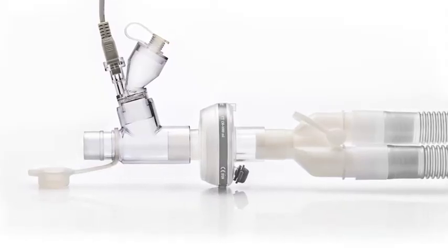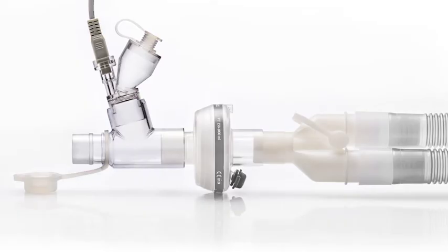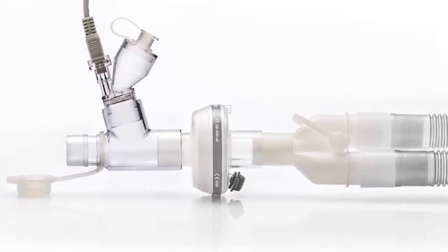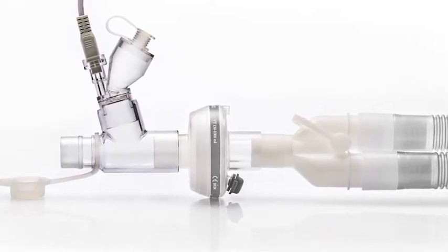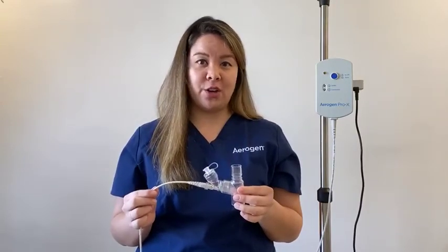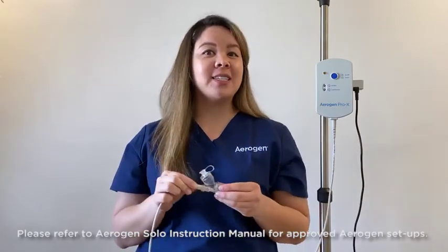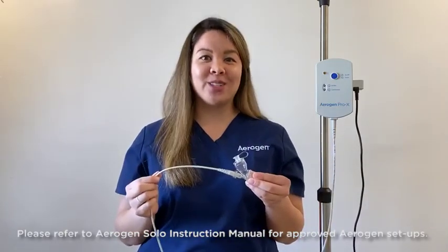If using Aerogen with a heat-moisture exchanger, the Aerogen Solo should be placed in between the HME and the endotracheal tube. Only an HME approved for use with a nebulizer should be used in this configuration. For patients who are extubated from mechanical ventilation, please see the Aerogen Ultra training video. If you have any additional questions, please contact your Aerogen CCS or clinical educator following this training.